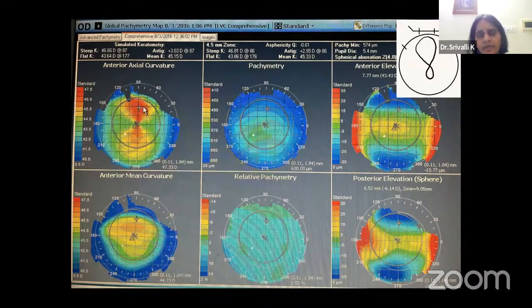And when you look at your case pre-operatively and post-operatively, do your keratometry, which is the simple way of knowing your astigmatism, and then you will start to understand all these images that we are talking about. Always start with the simple things that you're doing. See every patient with that aspect in your mind, and then you'll start picking up many more findings.